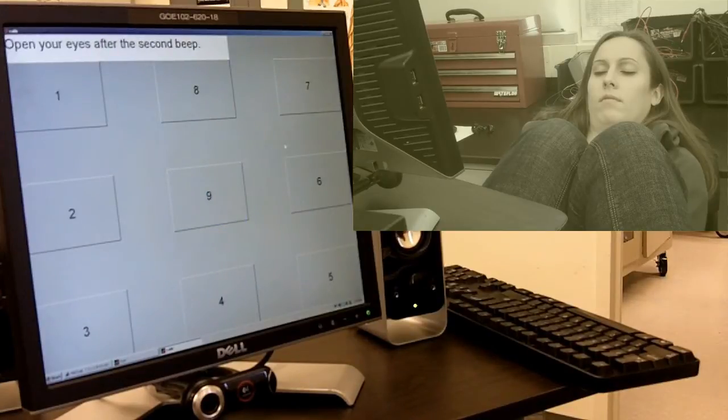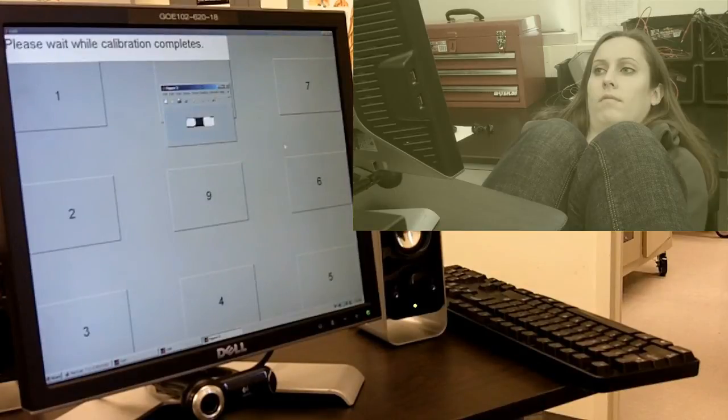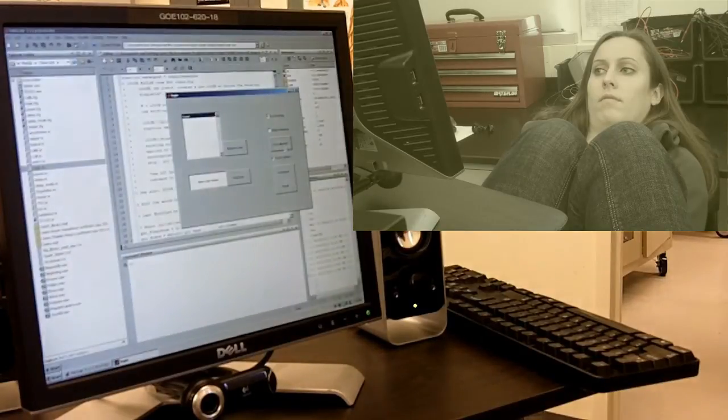Good. Now we're going to use the eye tracking based keyboard. So Hannah has the ability to look around, all around this keyboard, and select the bin or the letter that she's looking for. We started about Thanksgiving of last year. That's when our group came together, and we actually got our project assignment, what they wanted us to do.